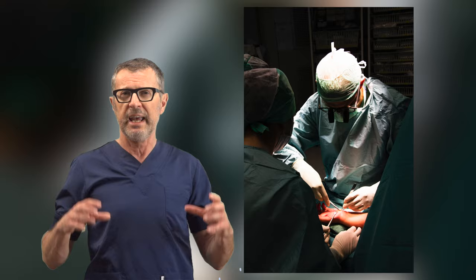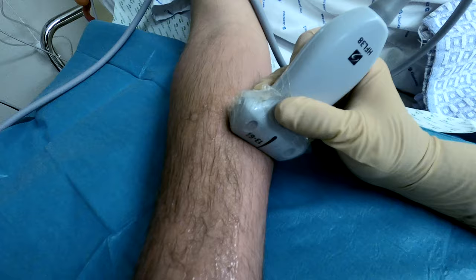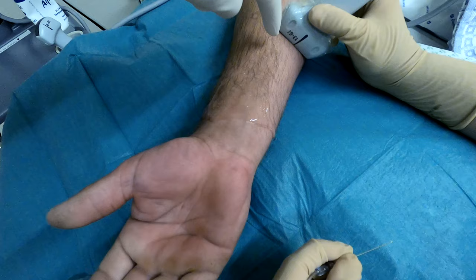So here we are going to do a carpal tunnel syndrome surgery. We are going to use ultrasound to accomplish a median nerve block and an ulnar nerve block, with local anesthetic infiltration for the skin only — for any remaining branches of the superficial radial nerve, musculocutaneous nerve, or antebrachial cutaneous nerve. So we need: median nerve block, ulnar nerve block, and cutaneous infiltration. Let's get started.